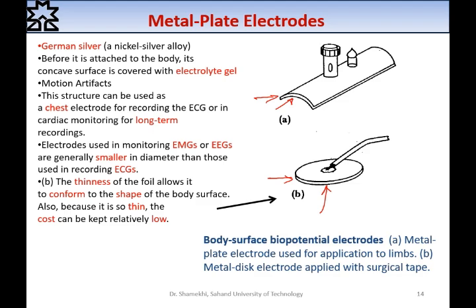In this metal electrode, as you know, metal electrodes are polarizable electrodes. Therefore, these polarizable electrodes need some fixation.